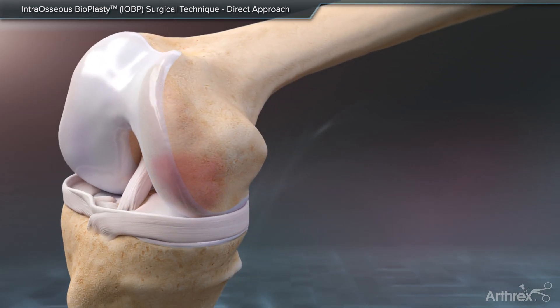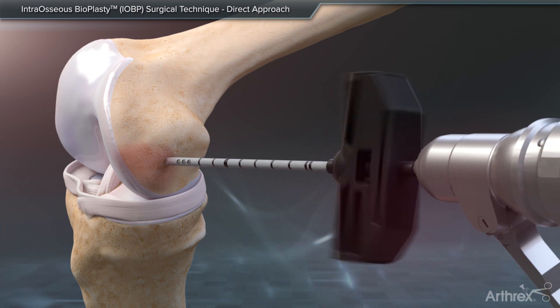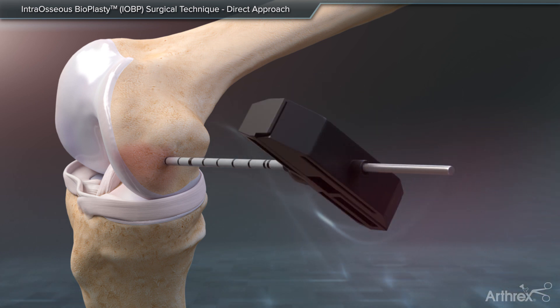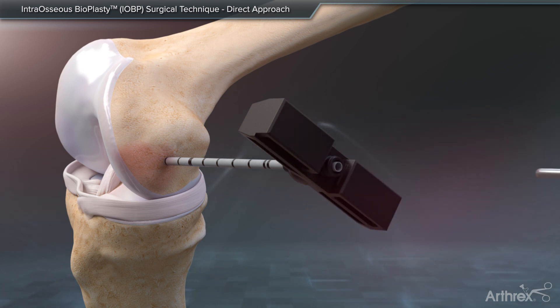First, position either the open-tip or closed-tip delivery cannula adjacent to the bone marrow lesion and according to the MRI. Insert the delivery cannula utilizing fluoroscopic guidance to ensure the cannula is positioned appropriately into the subchondral bone. Then, remove the inner stylet to complete core decompression.